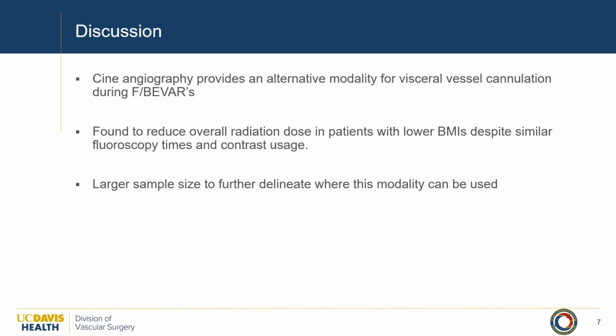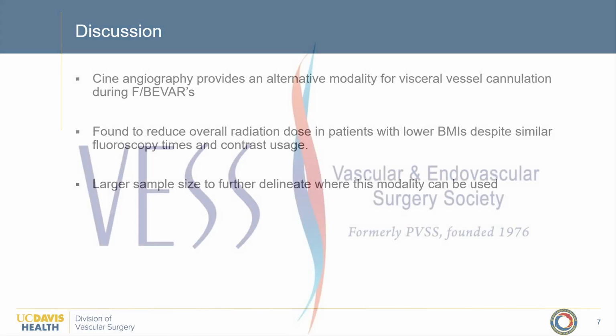Overall, Cine mode was found to reduce our radiation dose in some patients with lower BMIs, but in patients with a larger body habitus, DSA may still be required to achieve optimal visualization. We obviously still need to collect more data. Our sample size was limited in this preliminary set, and that will help us better determine which factors are significant. I can take some questions now.